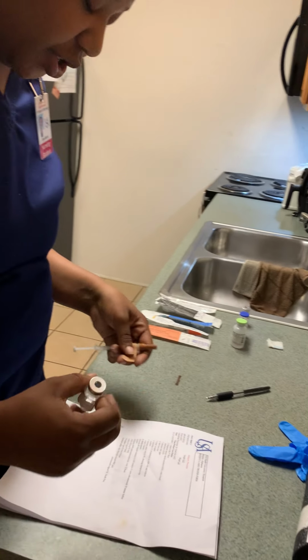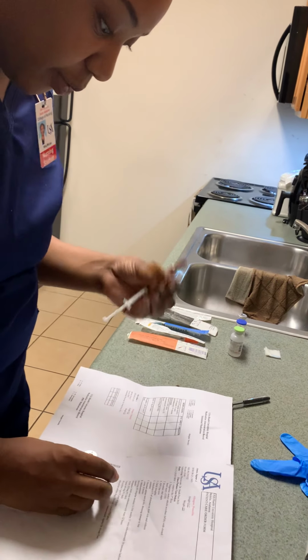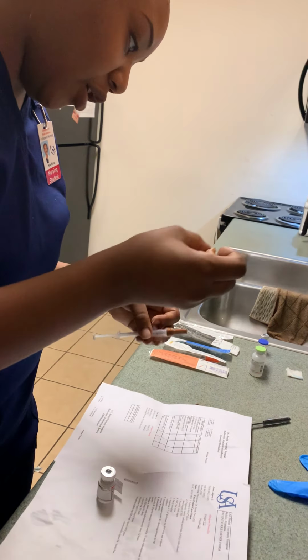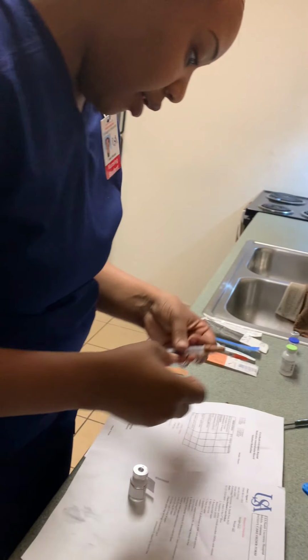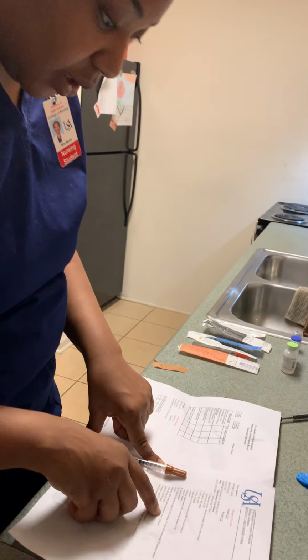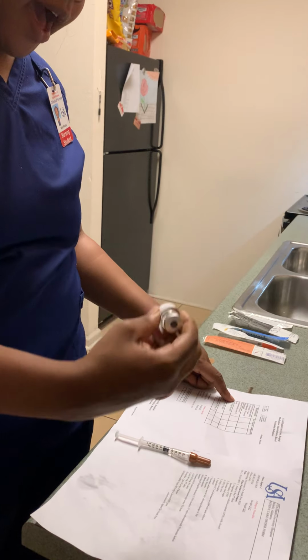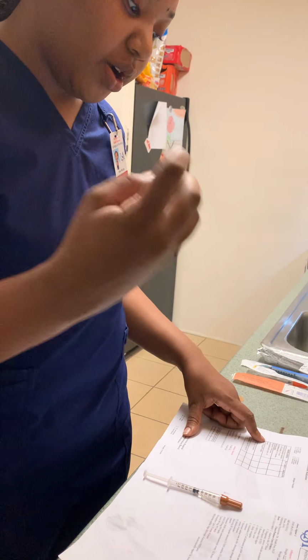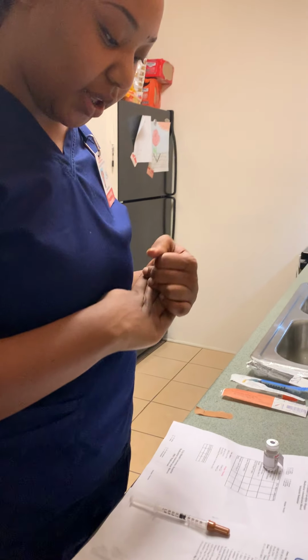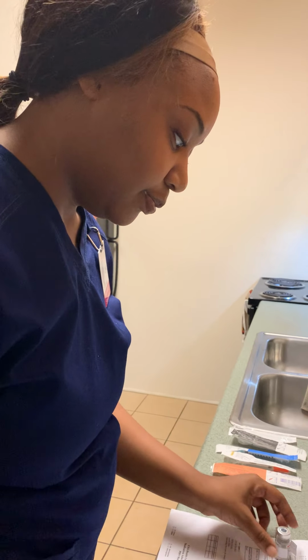I would check my information one more time. I have 0.5 milliliters of heparin on my tape, and I needed heparin given at 5,000 units subcutaneously every 12 hours. I have 10,000 units of heparin here, and my calculations were to retrieve 0.5 milliliters of heparin, and that is what I have here, and that is what my nurse checked as well.